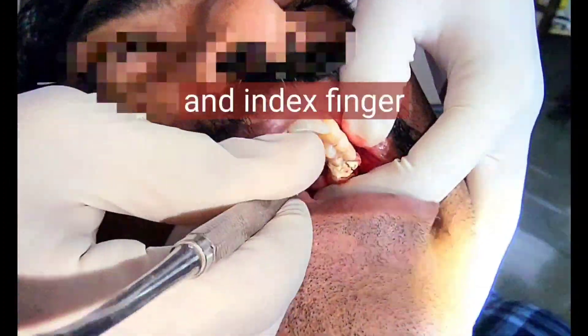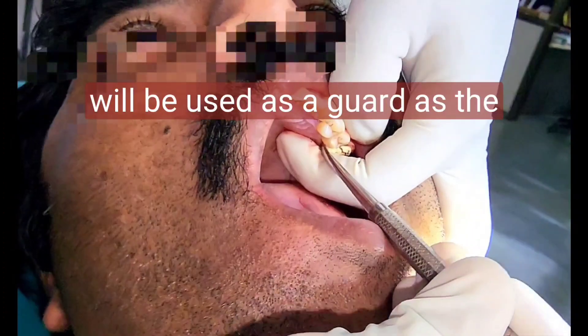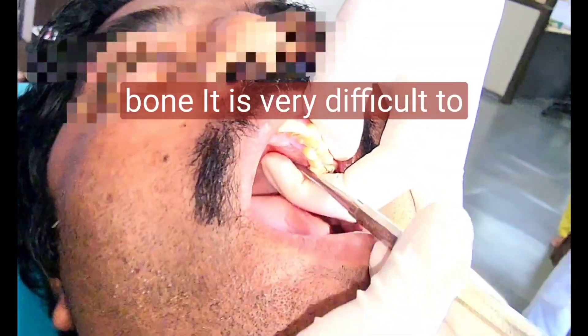Your index finger will be used as a guard. As the palatal mucosa is quite tightly adherent to the underlying bone, it is very difficult to reflect palatally.